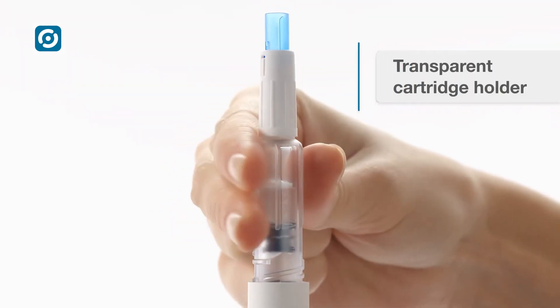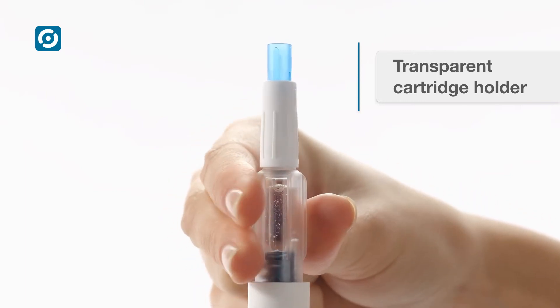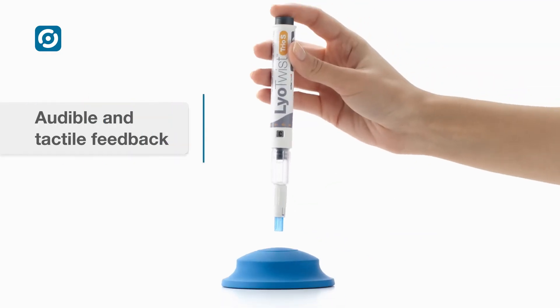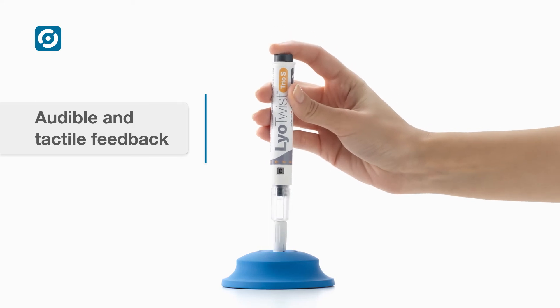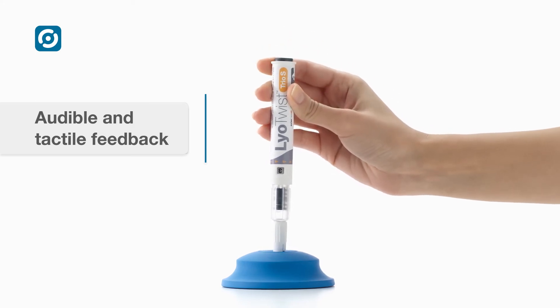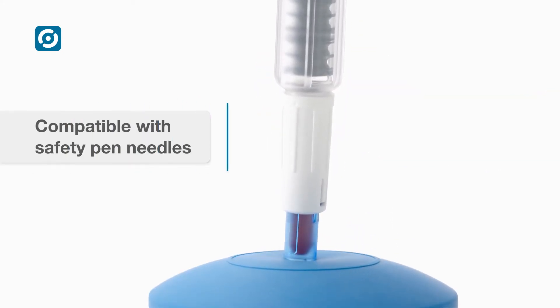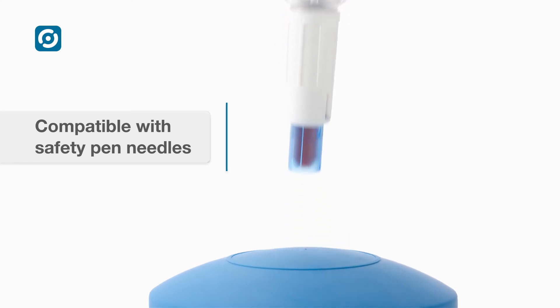The transparent cartridge holder provides full visibility of the cartridge for maximum patient confidence. LioTwist provides audible and tactile feedback during reconstitution and priming and at the end of injection. Needle safety is provided in combination with Ipsomed's safety pen needles.